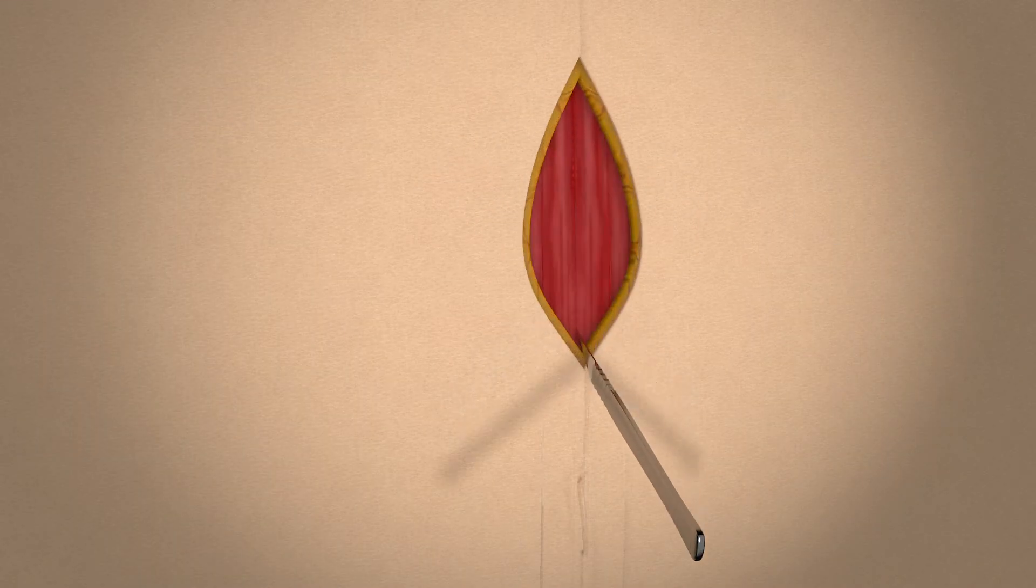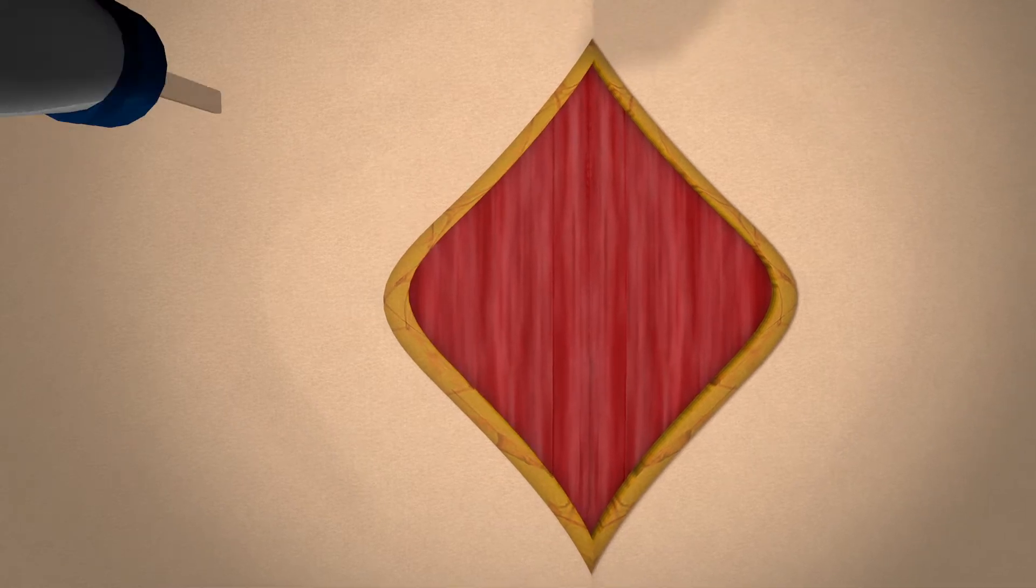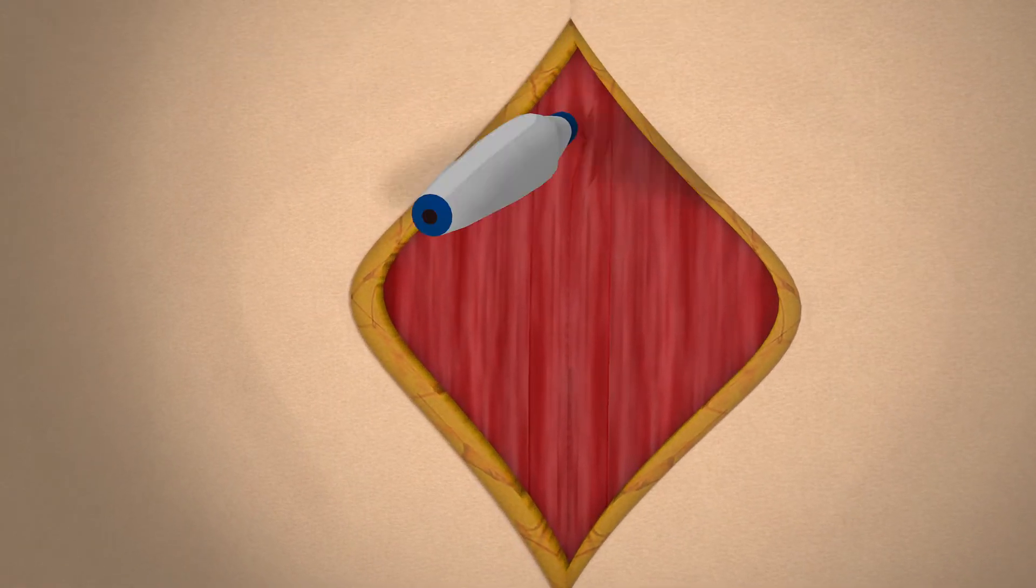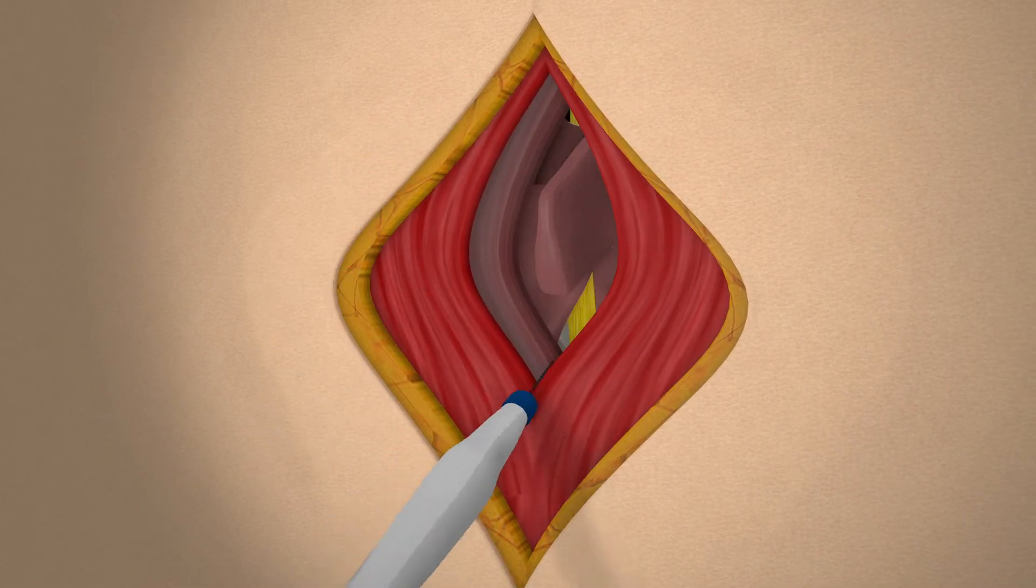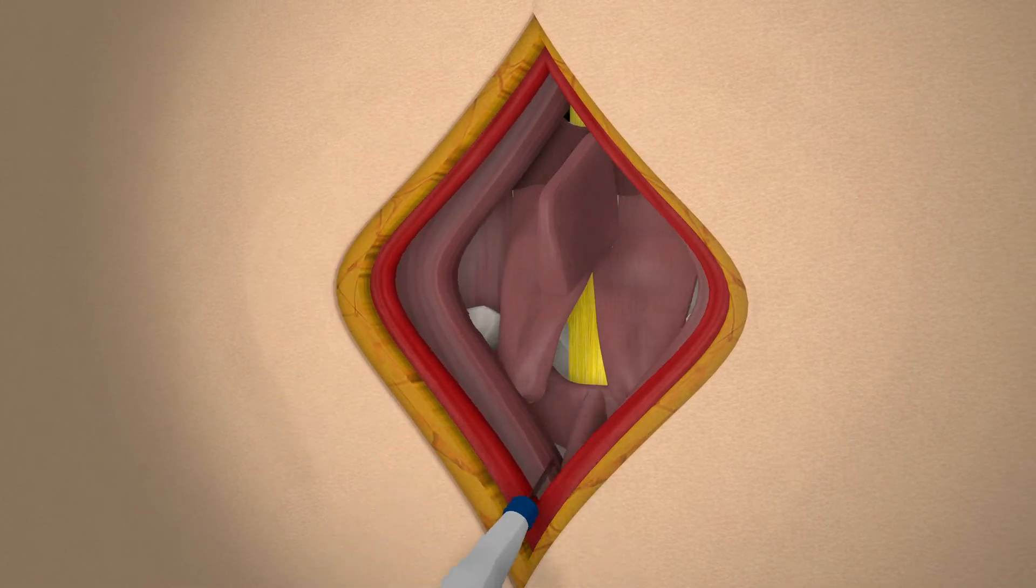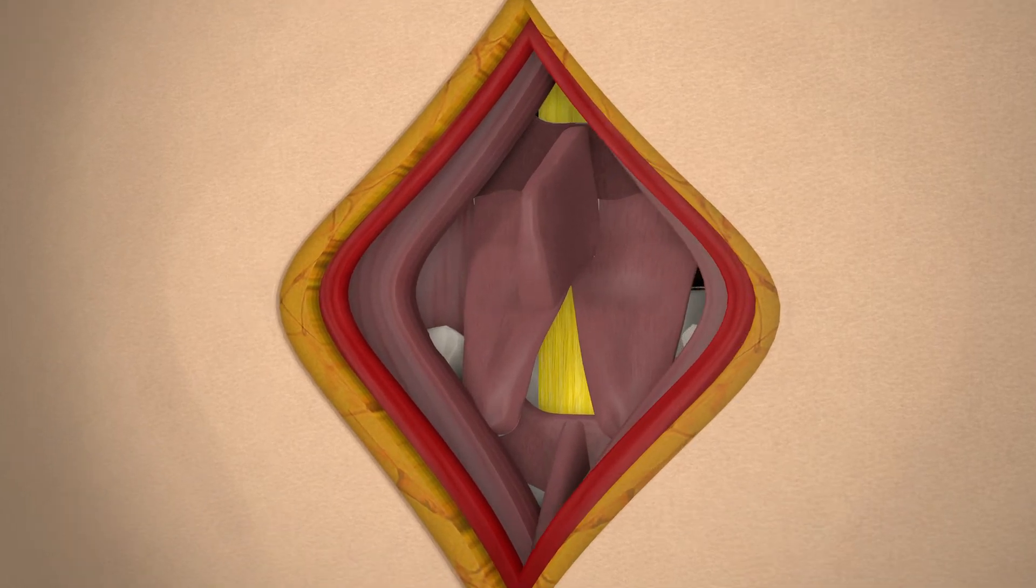The first incision will be from the L4 to L5 region on the posterior portion of the back. Electrocauterization will be used to cut deeper through muscles and to clean around the vertebral body. This tool is used to reduce bleeding from surgery, remove abnormal tissue growth, and prevent infection.